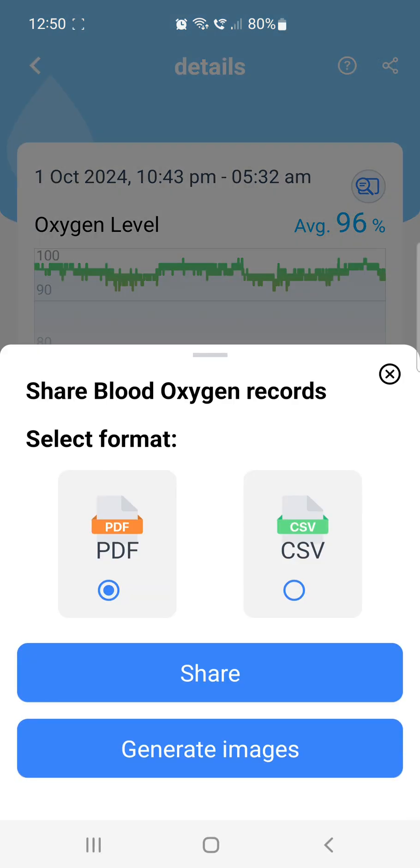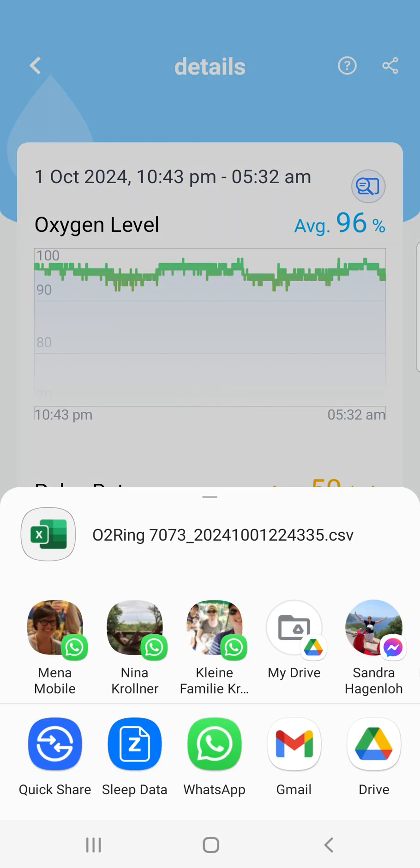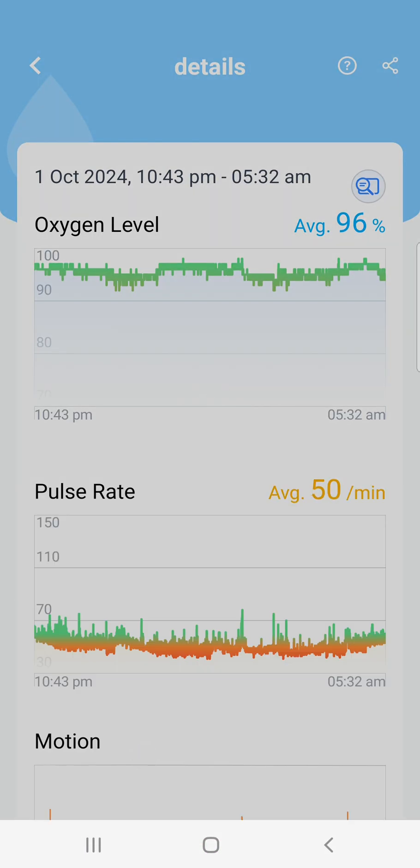When it asks for the file format, make sure to choose CSV. In the Data Sharing screen, select the Sleep Data app.